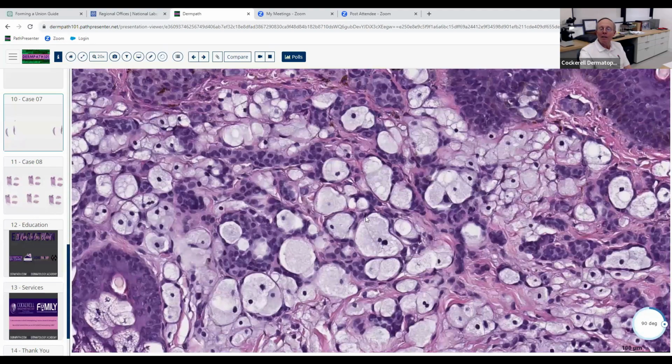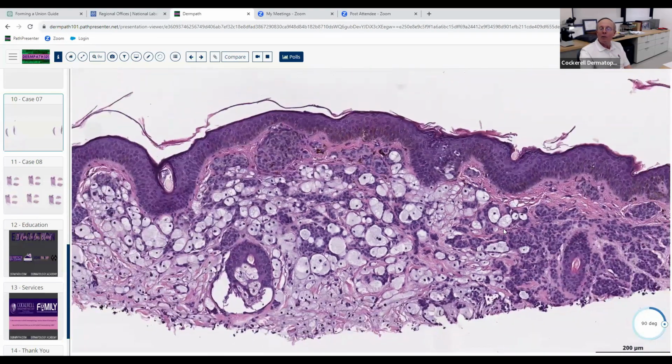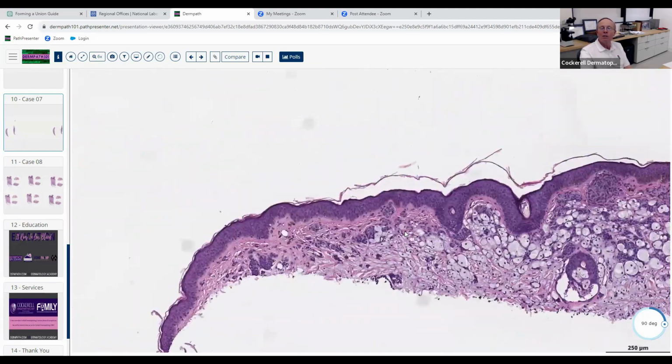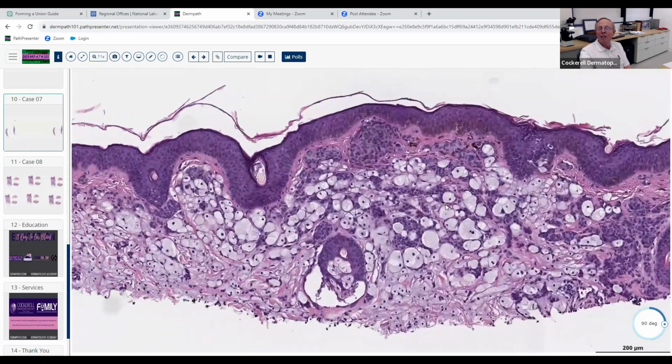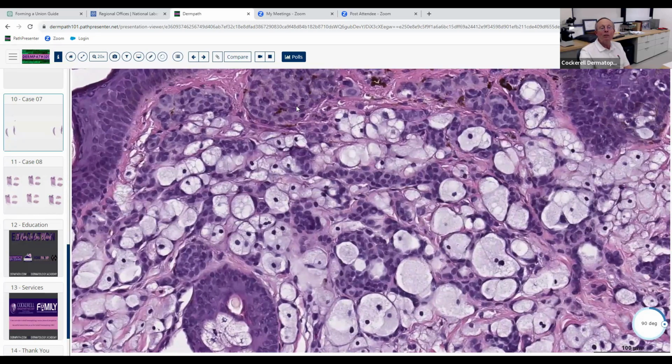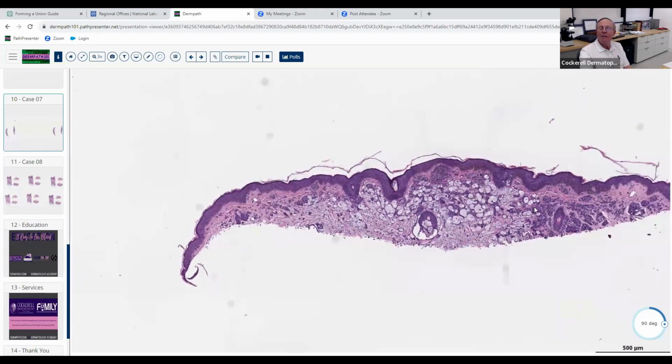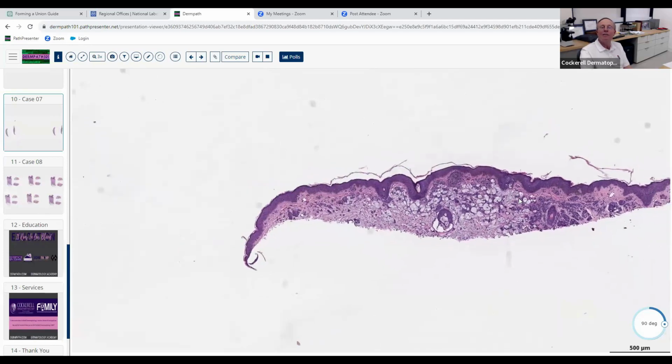Yeah. Balloon cell nevus. There's a bunch of different types of nevus cells. It's another mantra that Dr. Ackerman used to teach us. Large cell, small cell, pagetoid, balloon, oval, spindle, multinucleate, dendritic. It's pretty much all the different types of melanocytes that you can see. So these are balloon cell nevus cells here, admixed with small round cells. Okay? Balloon cell nevus. One of the 8 types of melanocytes that can cause a benign nevus.